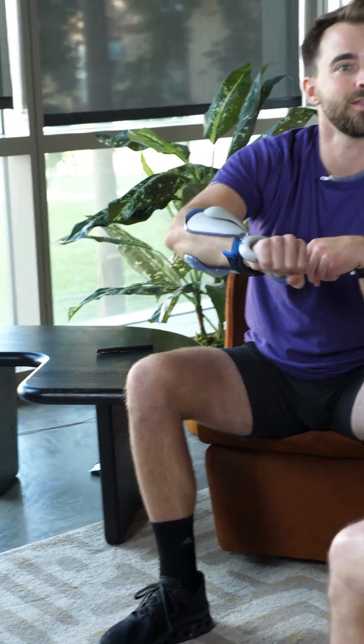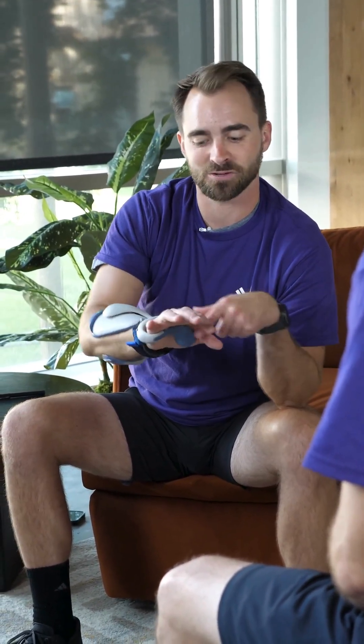So we're turning them on from here with those electrical impulses, and we want to make it functional. We actually want to use it to reach and grab onto things and then let them go. A lot of folks that I see haven't been able to do this in a long time because they're not able to use that hand, so we want to train their body to start doing functional tasks by turning on their muscles.